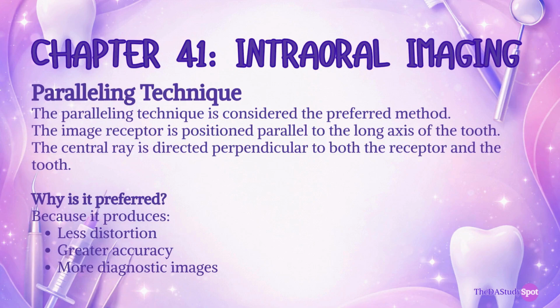This is probably the most tested concept in radiography. The paralleling technique. The paralleling technique is considered the preferred method. The image receptor is positioned parallel to the long axis of the tooth. The central ray is directed perpendicular to both the receptor and the tooth. Why is it preferred? Because it produces less distortion, greater accuracy, and more diagnostic images.